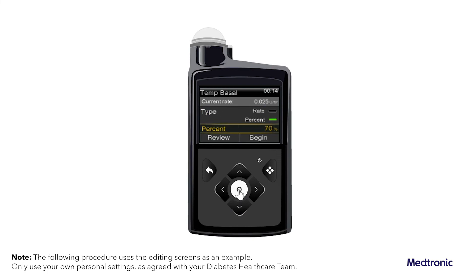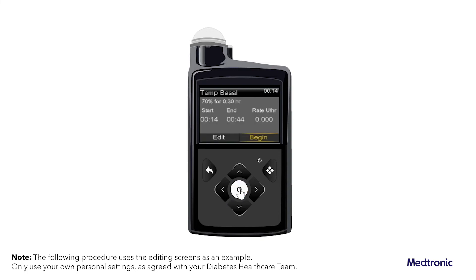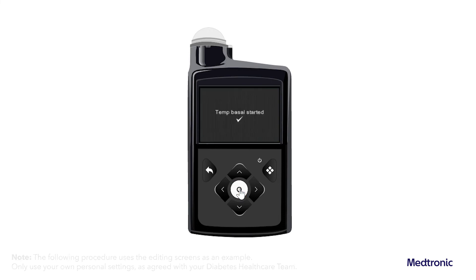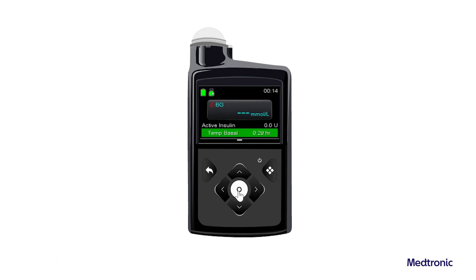Select review to review the temp basal setting. Select begin to start the temp basal rate. The temp basal banner appears on the home screen during delivery.